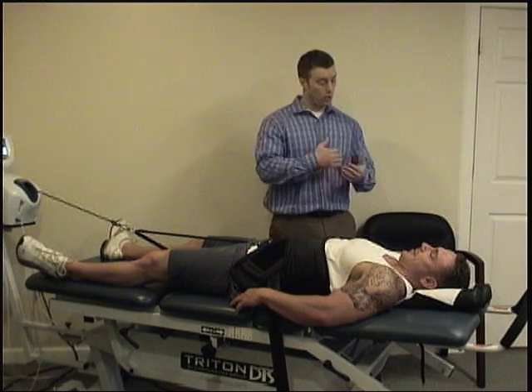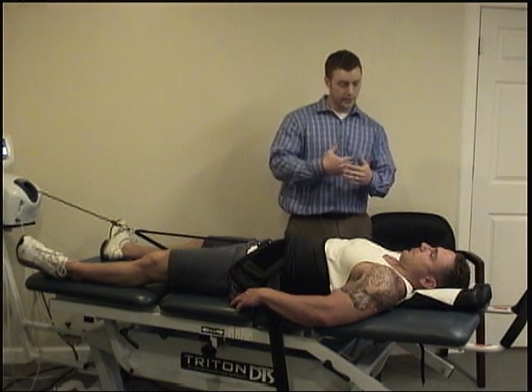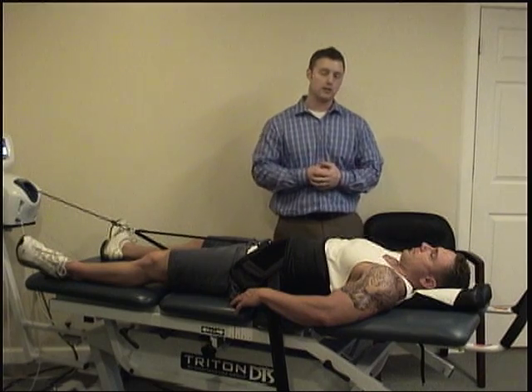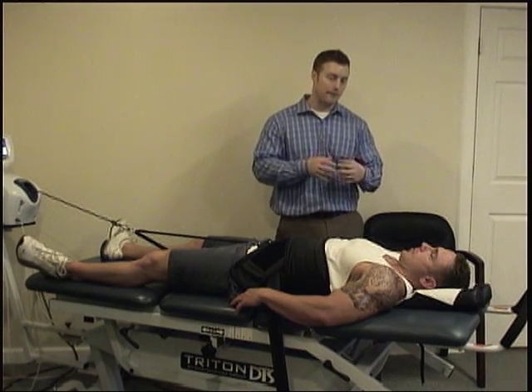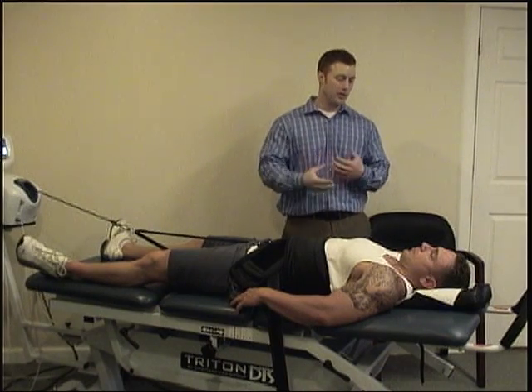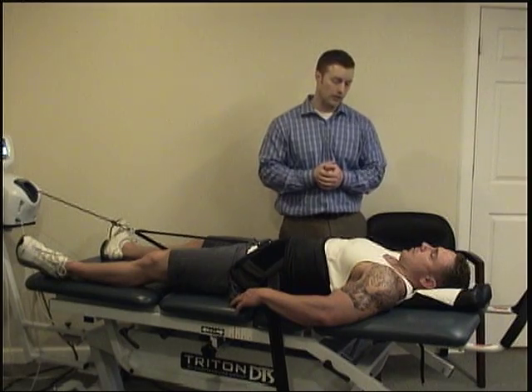What this is doing is it's going to pull and hold it for 30 seconds, then release some of the weight, hold it for 30 seconds, and then pull again. So what you're getting is a pull and release effect, thereby creating a pumping effect. That's how you're getting fluid back into the disc, rehydrating the disc, undoing all that pressure that's been put on from squats and deadlifts and things like that.